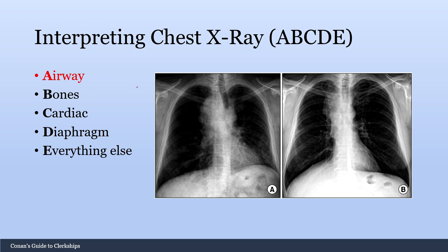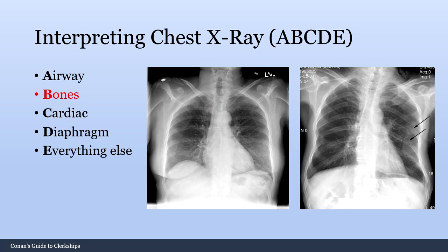A stands for airway. Check to make sure the trachea is midline, or note if it's deviated — as in this patient where the trachea is deviated due to a mediastinal mass. B is for bones. If you jump directly to the lung fields, you might miss important findings such as a clavicle fracture or rib fractures. Always check the bones before moving on to everything else.